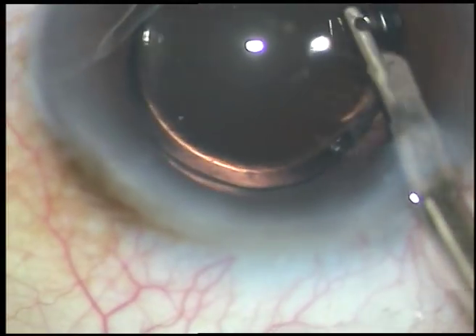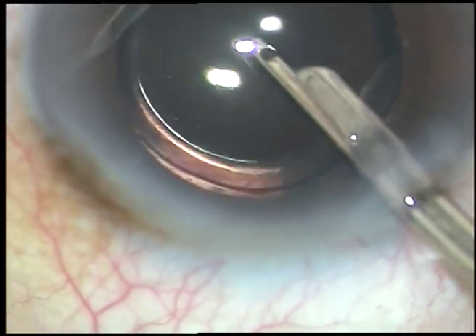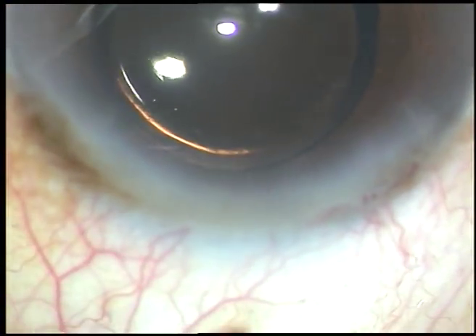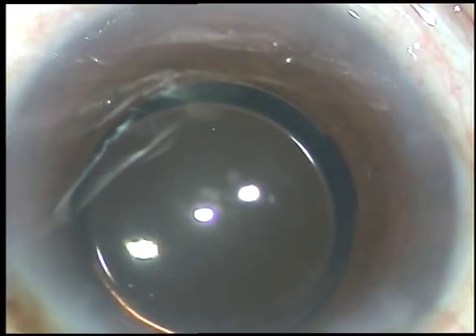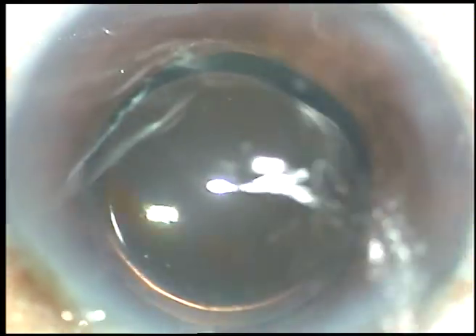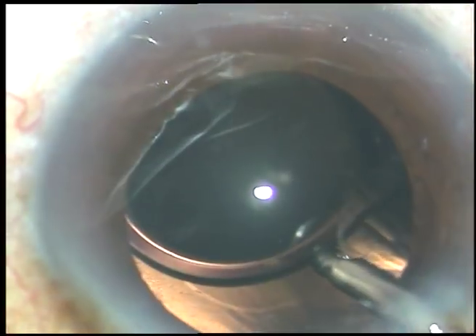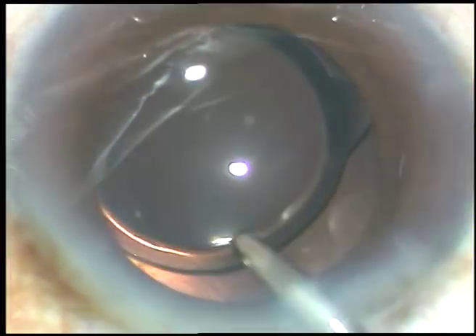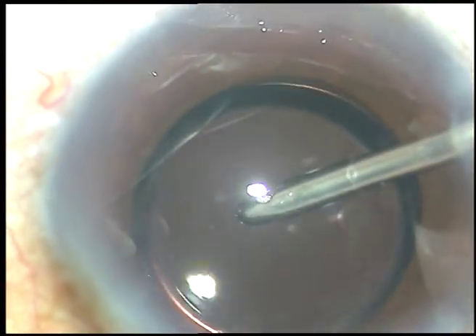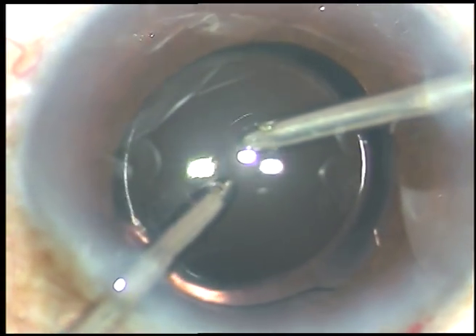Now, in this case, I am removing the viscoelastic substance. I am a thorough remover of viscoelastic substance because I want to see a very clear cornea and normal intraocular pressure after surgery. So I flush with the Simcoe cannula, flush the capsular bag, then use an irrigating probe to flush the anterior chamber. Then I use irrigation-aspiration together to remove the viscoelastic substance.